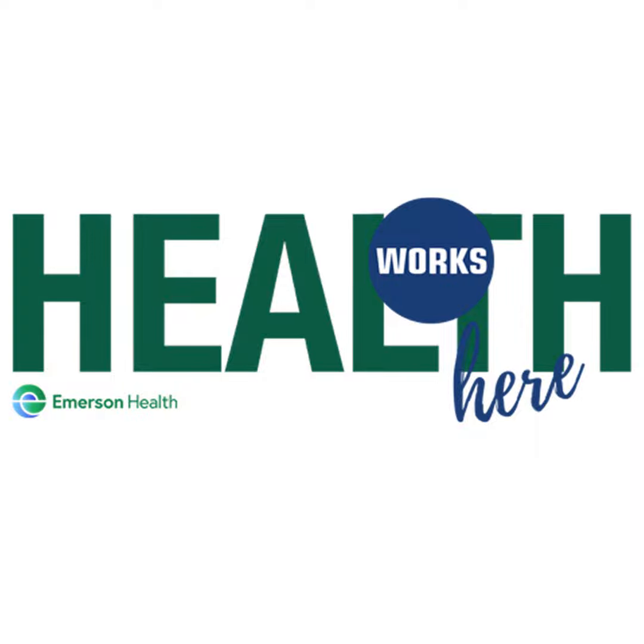I'm not sure of the exact idea in the marketing behind Mako itself. Yeah, and I assume I know the answer to this question, but I'm assuming that robotic-assisted surgery has many benefits, and it's certainly safe, right? The benefit of a robotic-assisted surgery is that we have a plan, just like you have a blueprint for a house when you're building one, and the plan that we have, we're putting in place as precisely as possible. So there's been a number of studies on robotic-assisted surgeries, and all of them agree that the implants go in more precisely than if you don't use robotic assistance.